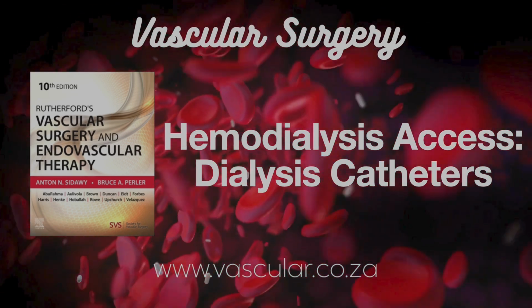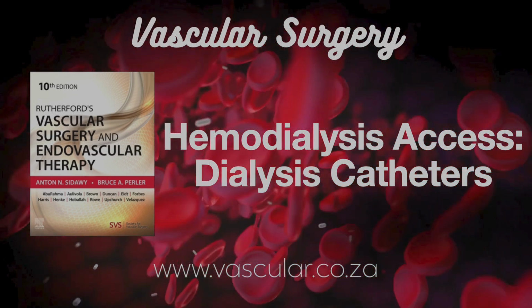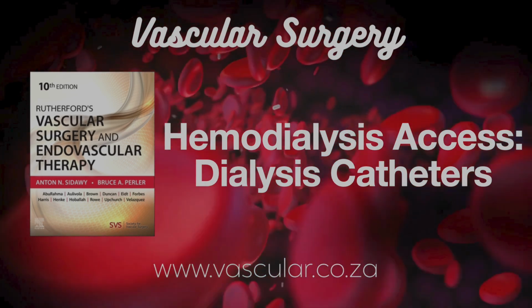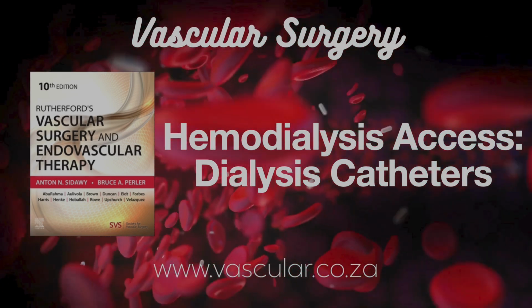Subclavian artery injuries are tough to compress. Watch for hemothorax. Okay, that's a lot to watch for immediately after. Let's talk long-term. How are these managed and what late complications pop up? Long-term care is mostly the dialysis unit's responsibility. Vascular surgeons usually step in for the later, trickier problems.